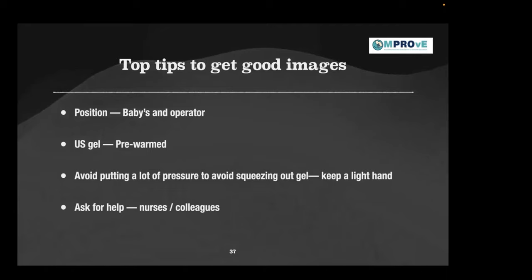And then, of course, always ask for help, be it your colleagues or nurses, to position the baby. As Alok has mentioned multiple times, it's very, very important to keep the baby contained so that the baby is not fighting with you or the scanner, so that you get good images.